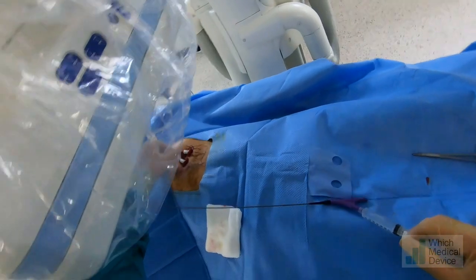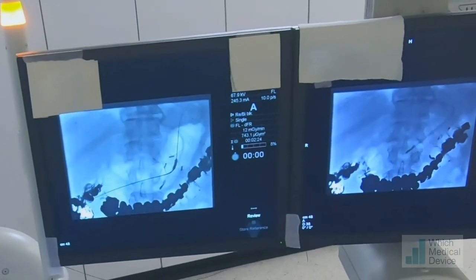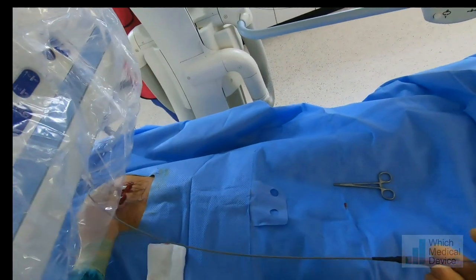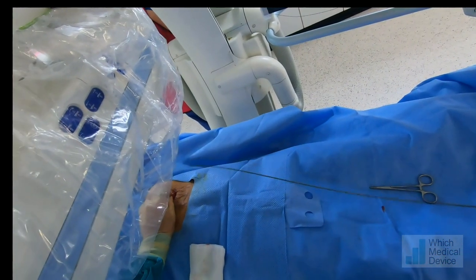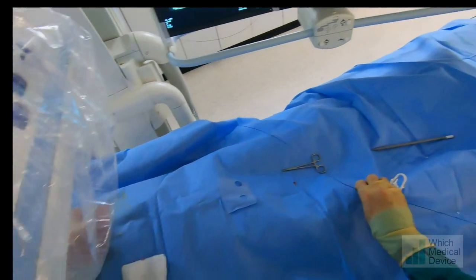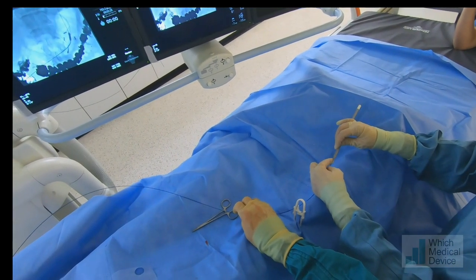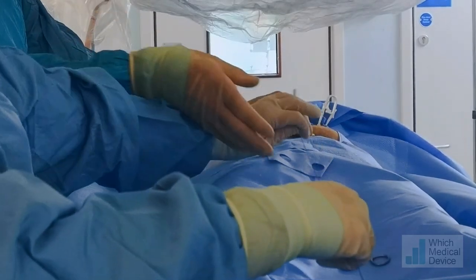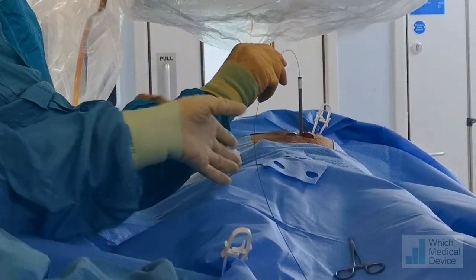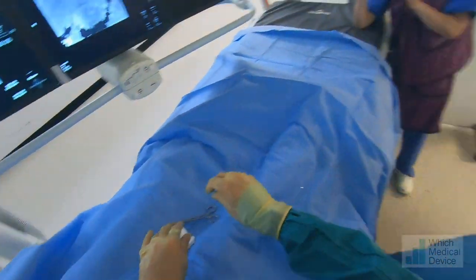3cm looks fine, though if in doubt go slightly longer. Now I'm re-inflating the angioplasty balloon to start the tract dilatation — you can see that on the x-ray. Deflating the balloon, we're going to insert a 20 French plastic dilator to finish the dilatation. The gastrostomy tube is 16 French, but because of the balloon on the end you need a 20 French dilated tract to insert it. A little more pushing with rotation and that's gone in very easily — leaving that in place while we get the gastrostomy tube ready.